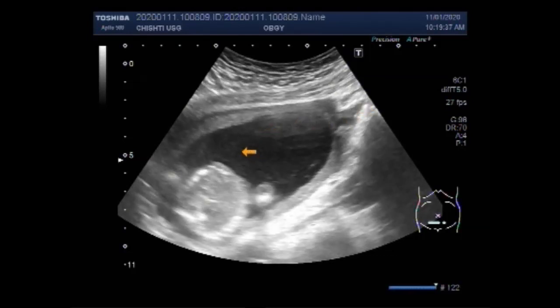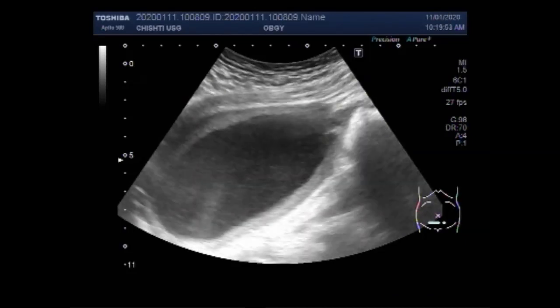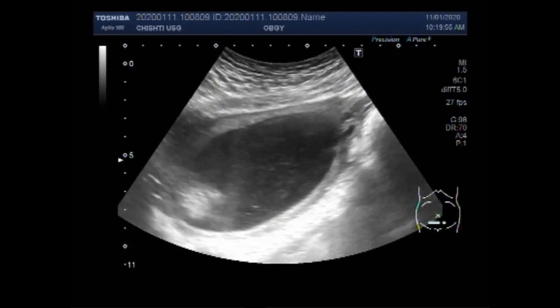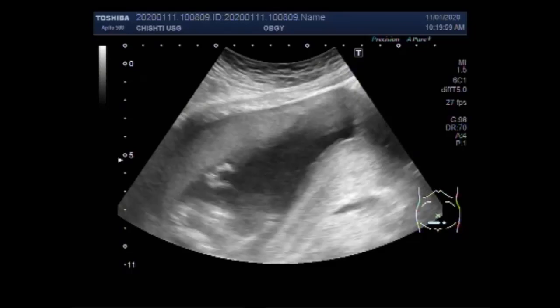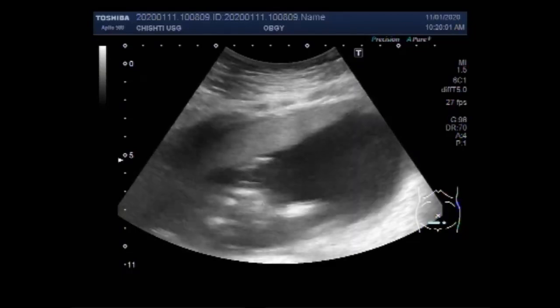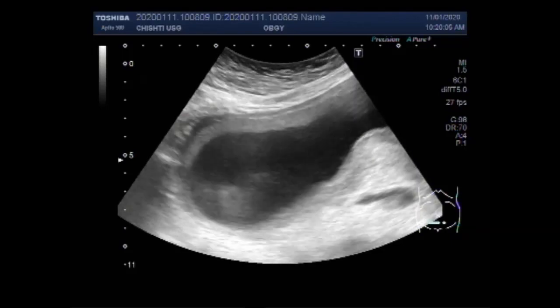The amniotic fluid is thick and turbid due to the passage of meconium in its interior. This is meconium in the amniotic fluid. These are the hands of the fetus.